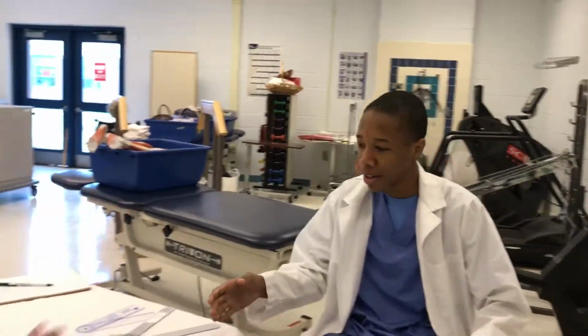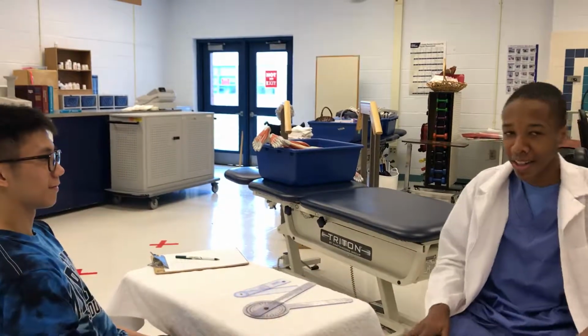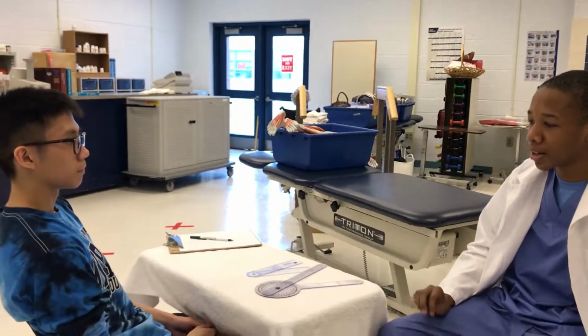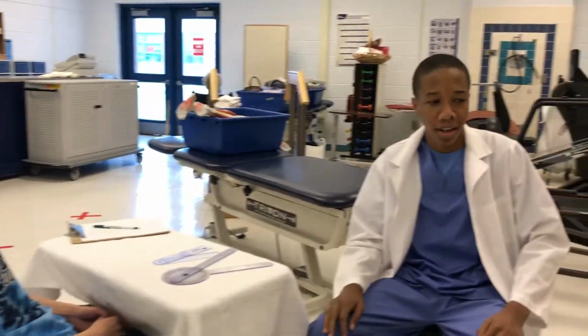greet the patient, hello, my name is Dr. Reggie, and explain the procedure that we're going to be doing today. So I'm going to be doing goniometry of elbow flexion and extension and wrist flexion and extension. Now, first part, I'm going to start with elbow flexion and extension.